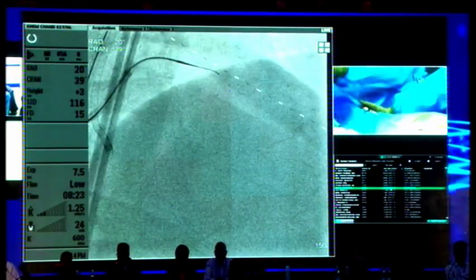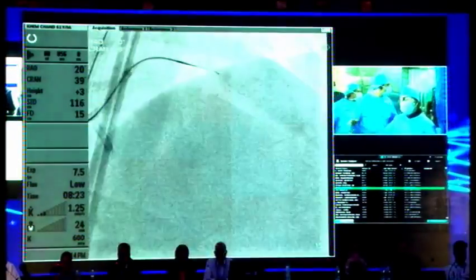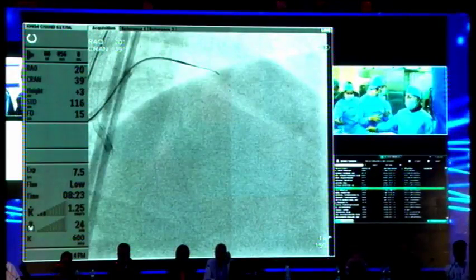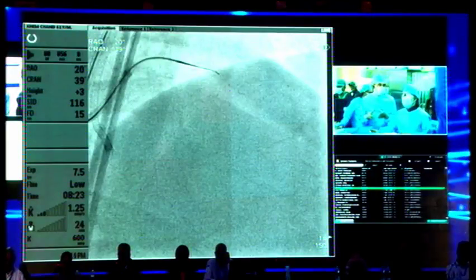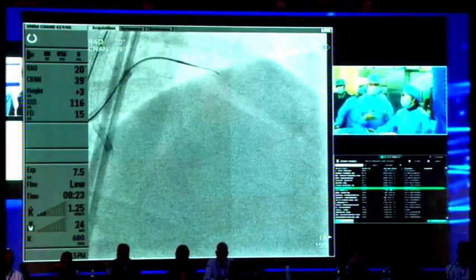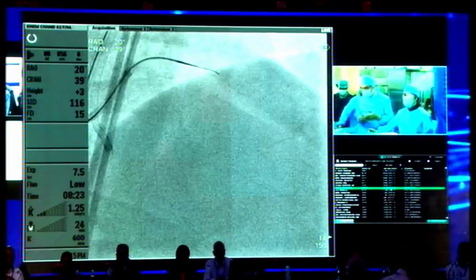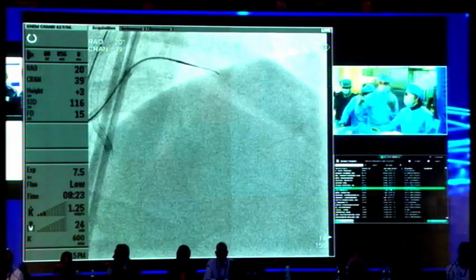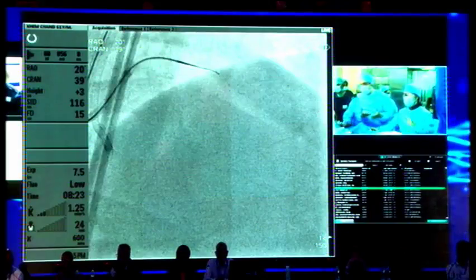Yeah, how are you? We have a case, you are going to give the history? History is already presented to you. A 45-year-old young male who was diabetic, non-smoker, with a strong family history of sudden death. He had angioplasty about 4 years back. He is not that symptomatic, some atypical symptoms. He got an angio because he was scared, which revealed in-stent LAD stenosis. Stent size was probably 3 into 20, something like that.